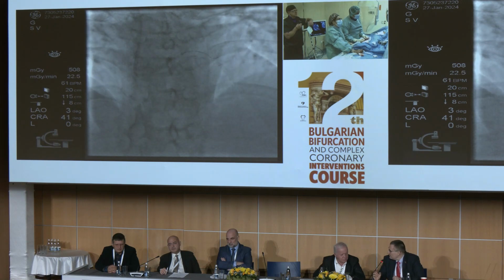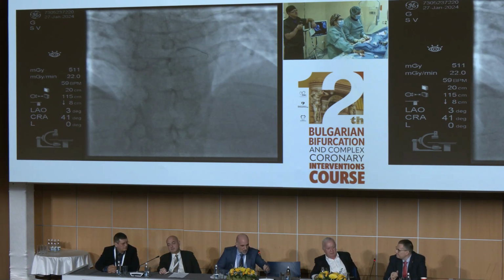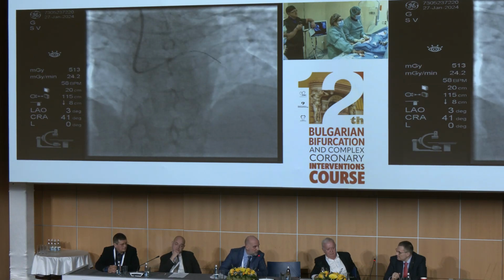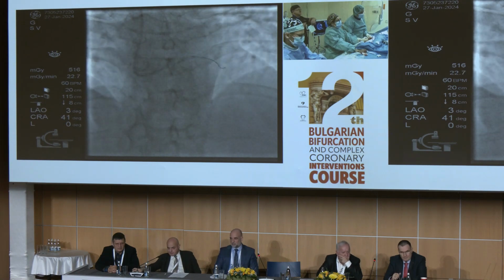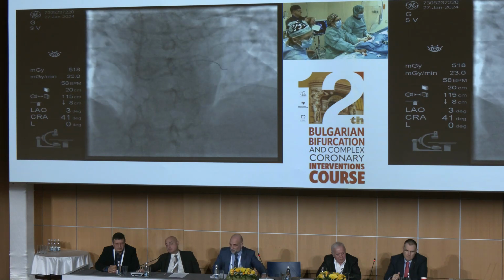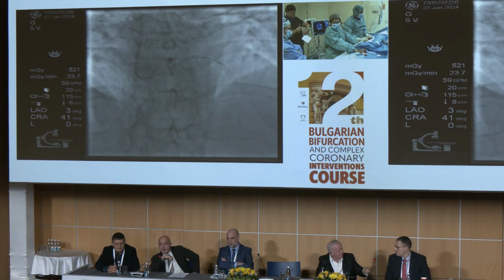Unfortunately, Dr. Mitov, what would be your approach at this moment? Our safety wire got entangled in the balloon, and we lost it. I agree with a new POT with a bigger semi-compliant balloon. Yeah, with 4.0. The IVUS made us feel confident about doing that, and we saw that with 3.5, as already anticipated, we are slightly undersized.